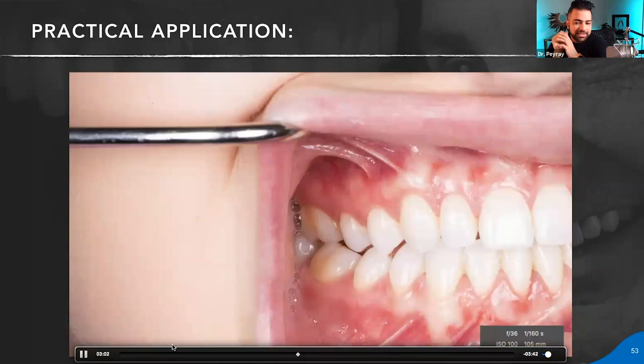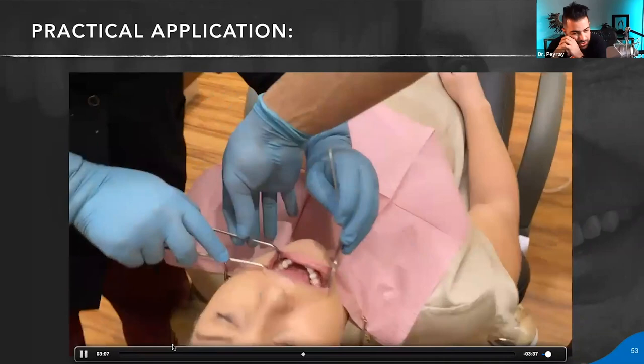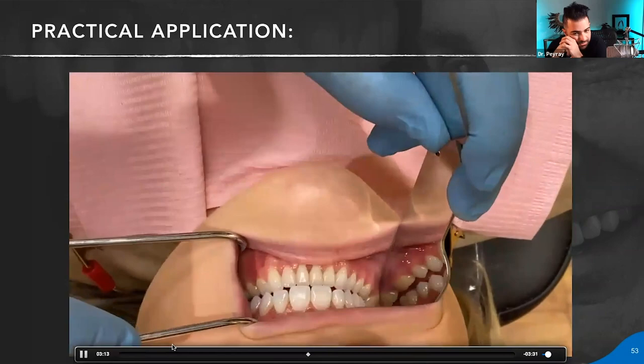This is what we get all the way back. The buccal shots are hard. So that's the metal retractor on one end and then the mirror on the other. Go ahead and bite down. And that is what I can capture. Now I could capture it from her view.